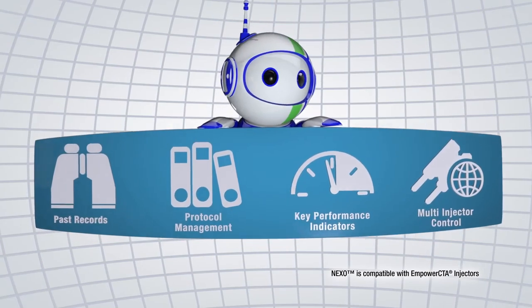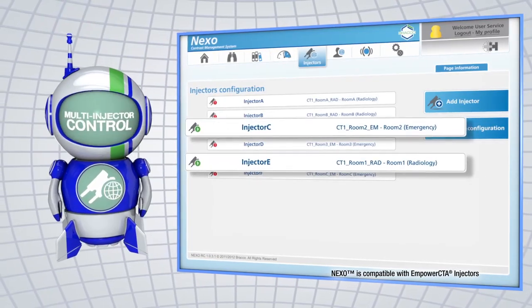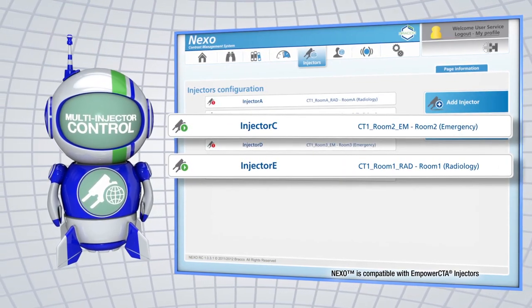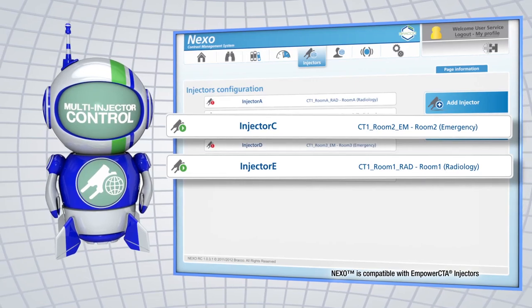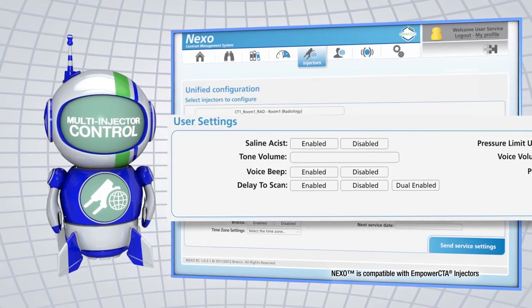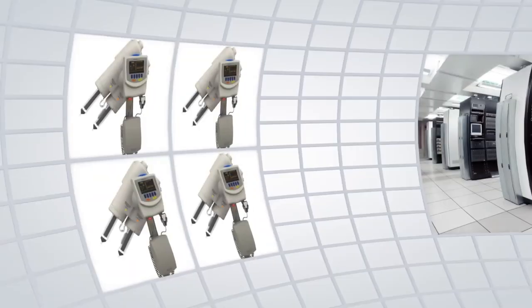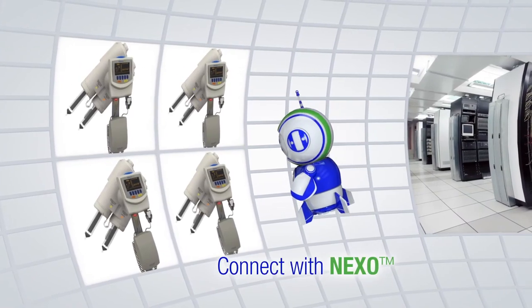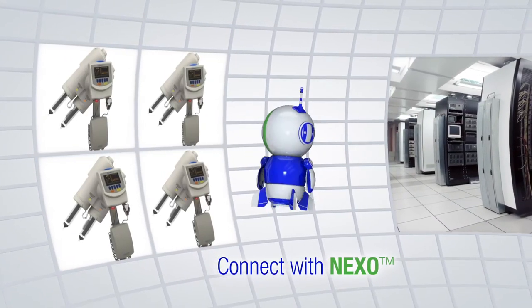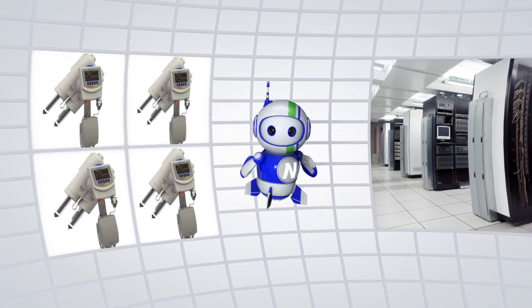Ready? Set. Nexo connects your CT injectors and internal informatics systems, offering actionable data to better manage workflow, patient care, and protocols. Injectors are connected and synchronized throughout your enterprise. The information you need is just clicks away on your web browser. Nexo automatically captures and sends injection reports to PACS. Multi-injector connectivity lets you treat patients while documenting procedures, supporting efficiency and care.